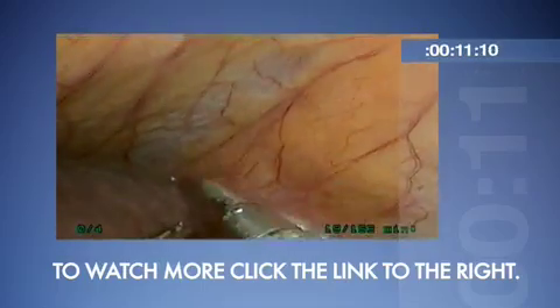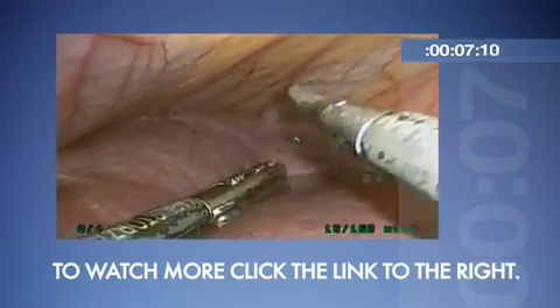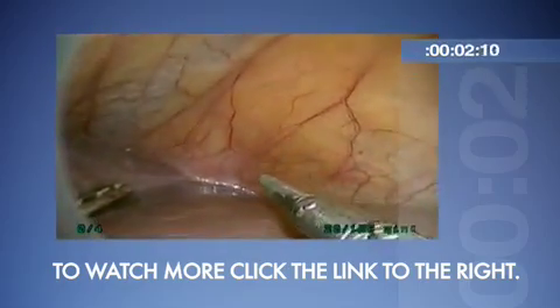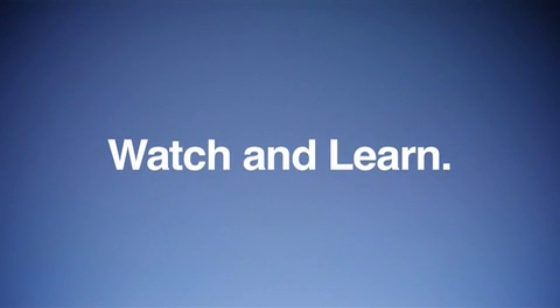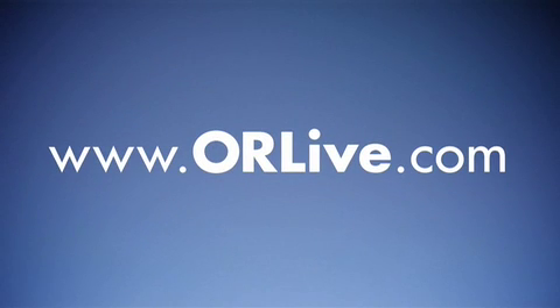The left lobe of the liver is visualized here, and this is an endoscopic view of the abdomen looking up towards the head from the belly button. You can see the liver, the falciform ligament, and you can even see the heart beating on the other side of the diaphragm through the white portion of the diaphragm. That white portion is called the central tendon, and you can see with these instruments I'm able to open the peritoneum — the lining of the belly — and then open that.